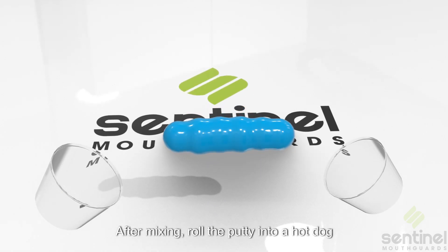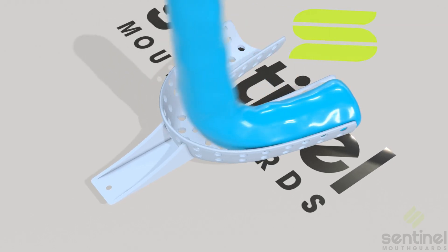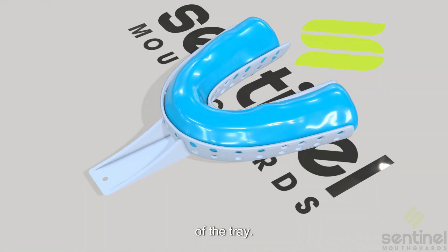After mixing, roll the putty into a hot dog shape and place it in the tray. Evenly push the material into all portions of the tray.